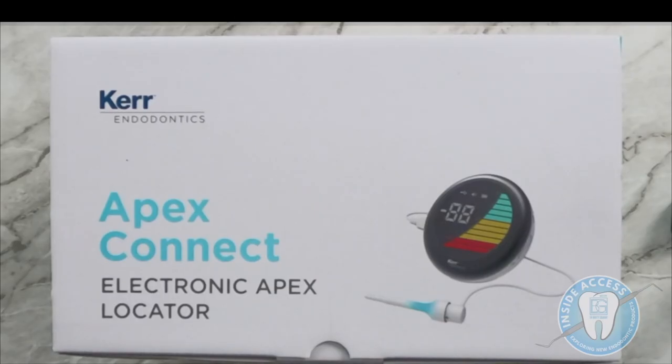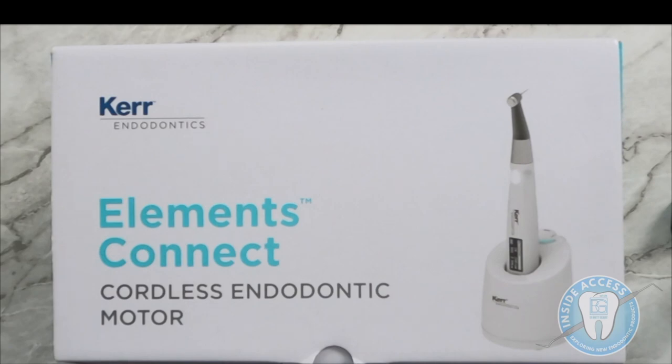One of the first products we're going to discuss is the new Apex Connect — an electronic apex locator that has some fairly innovative features. The next product is the Kerr Endodontics Elements Connect, a cordless endodontic motor with several important features. Interestingly, the Elements Connect and the Apex Connect actually connect together and become one device for real-time apex location while filing.